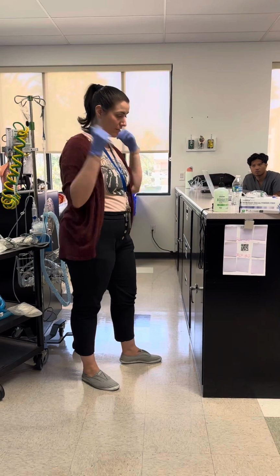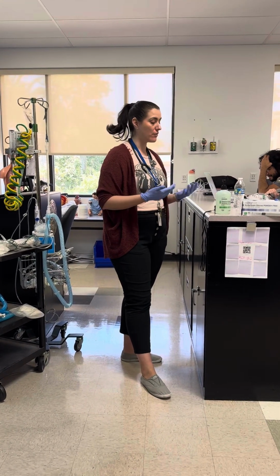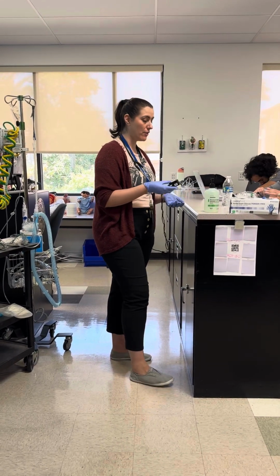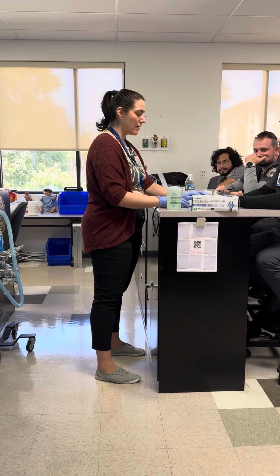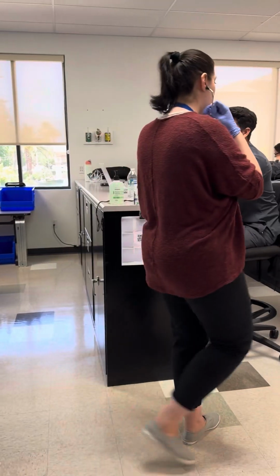So you'll have your stethoscope, you'll have your pen that can help make these notations. You're gonna be checking the vitals on me, so I'll be coming up to my patient. My tactics for checking vitals are as follows. I like to get my pulse ox first, make sure my patient can rest their hand on the table, because it takes a moment for this thing to load. So while the pulse oximeter is loading, that's when I like to come and check my breath sounds.